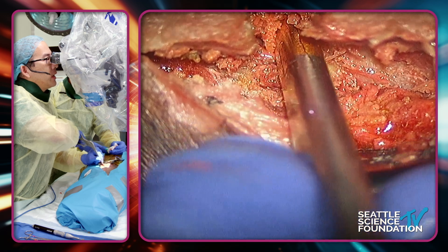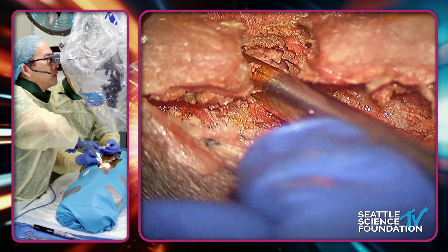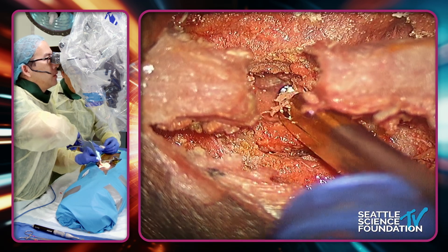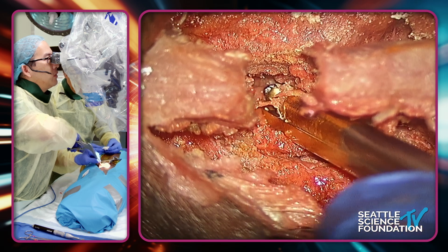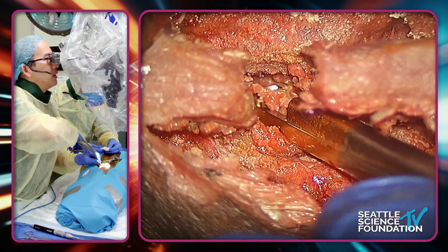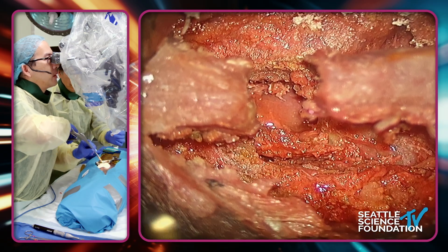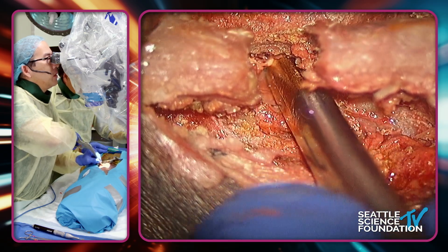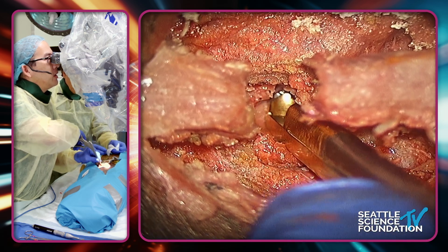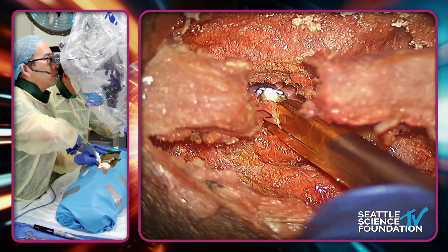This is where I think the advantage of CoFlex lies — that you can really see this from a contralateral perspective. Here's the L3 nerve root; I can feel that I'm completing the decompression here. If you leave behind this ligament, the patient's not going to be happy with you because it's still compressive. Often you can leave the epidural fat there — but now you see it's completely free here.